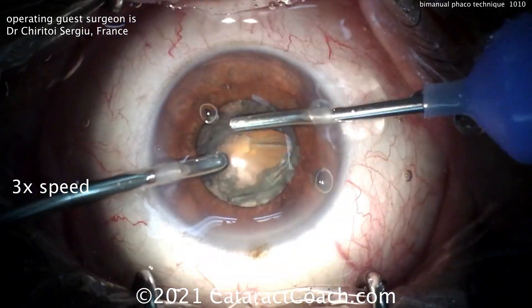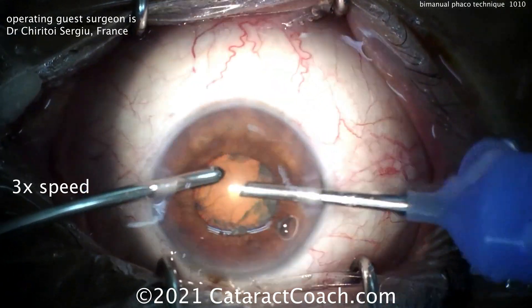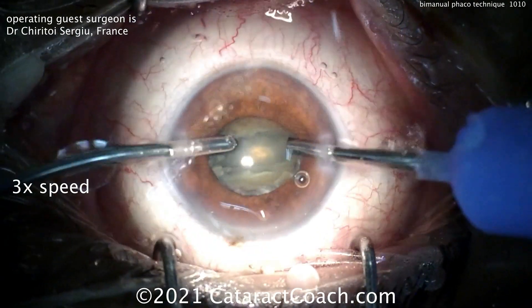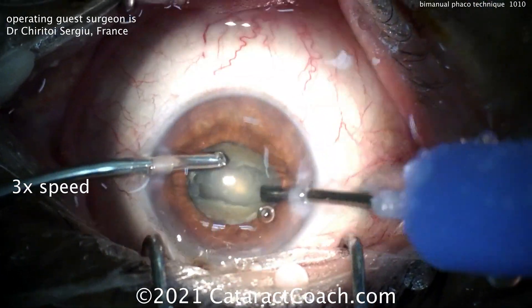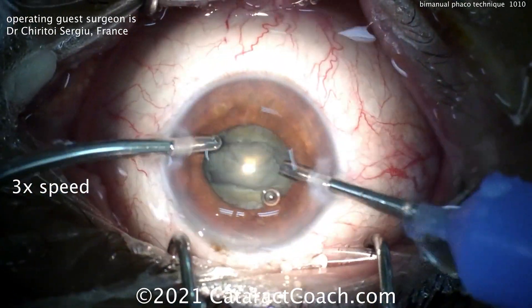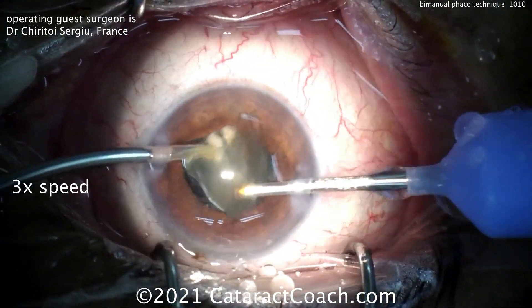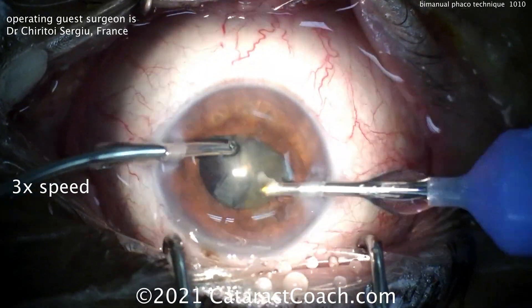In the right hand is the FACO tip, and the left hand is the infusion. People even made choppers that had infusion on them, so an infusion cannula would have a chopper tip on it. In this technique, a groove is going to be made down the middle. Now look at the FACO needle — there's no sleeve on it, which means that metal needle is in direct contact with the corneal incision. You need FACO power modulation so you don't build up too much heat and cause a wound burn. You also need a relatively leaky incision so the exiting balanced salt solution that goes around the FACO needle helps to cool it down.